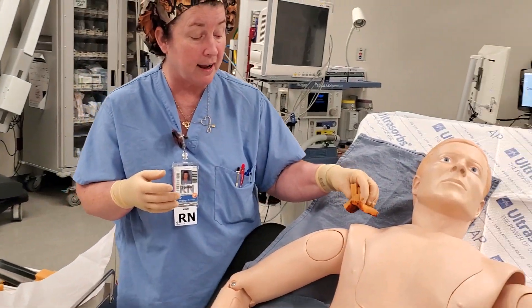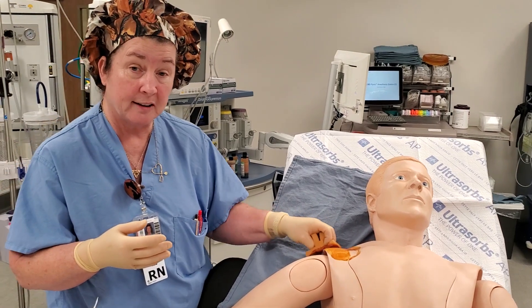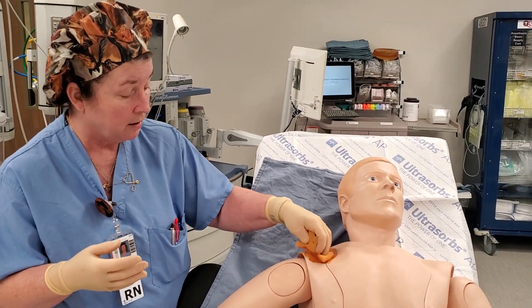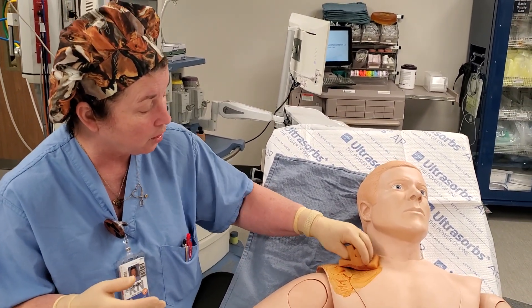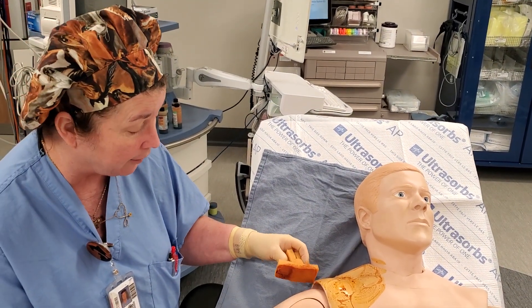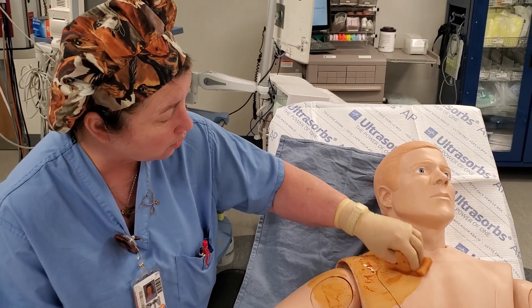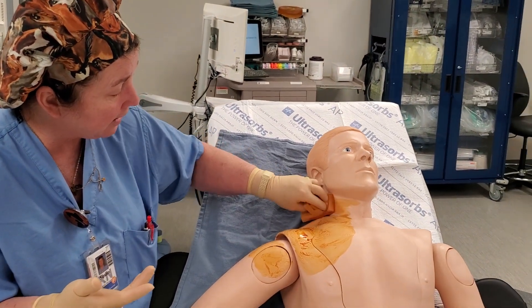We're going to start at the incision site and go in concentric circles, expanding out from there. You want to get as far back as you can depending upon how they're seated — all of the shoulder, making sure to include the side of the neck.